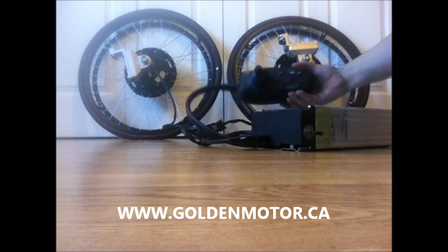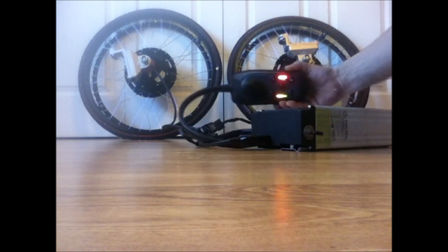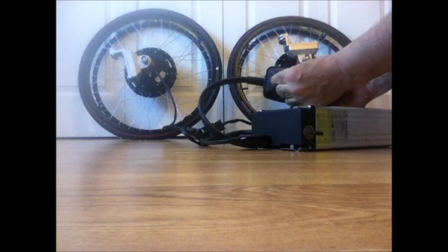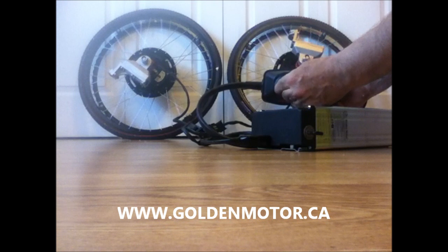Turn the battery on. On the controller there's a power button here — push it. We've now got lights on the controller, and if you can see up here you'll see some rotation when I move this stick. You can see that the motors will go according to what is pushed on here.